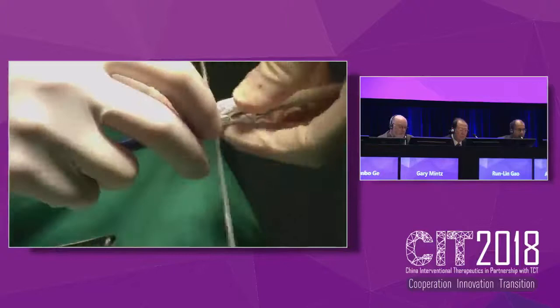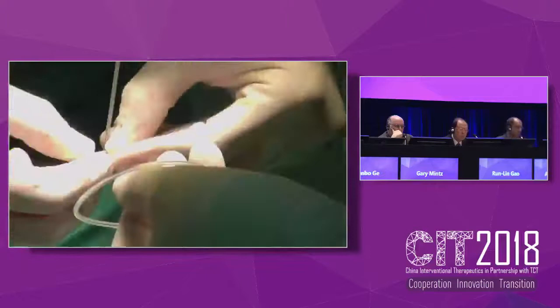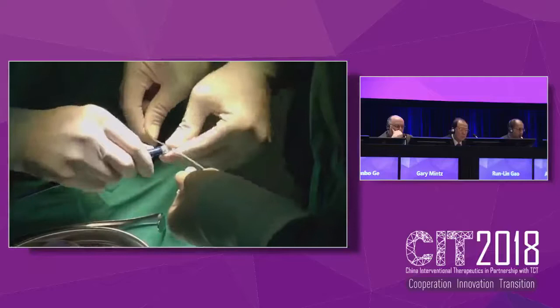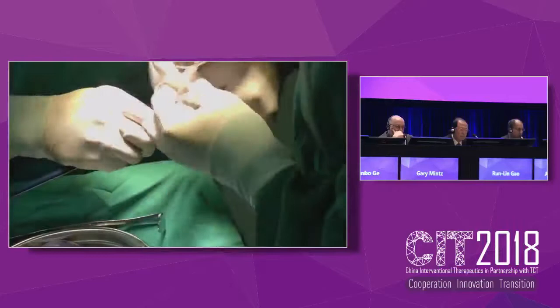So we are reassembling the device carefully. So that looks like it crimped reasonably well and went into the sheath. Can you see the device? Yeah. Okay, thank you. So we have almost finished reassembling the device. Okay, yes, keep going.